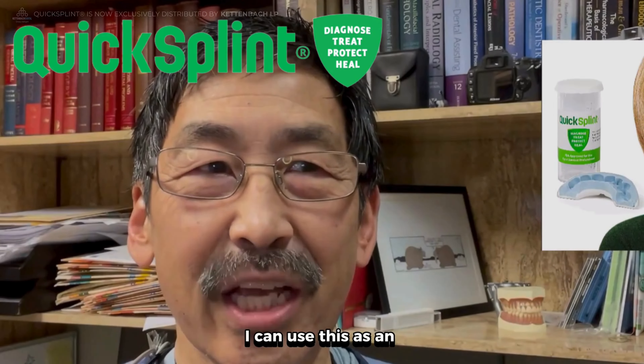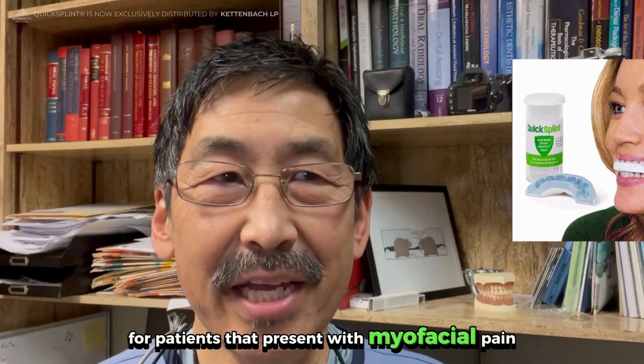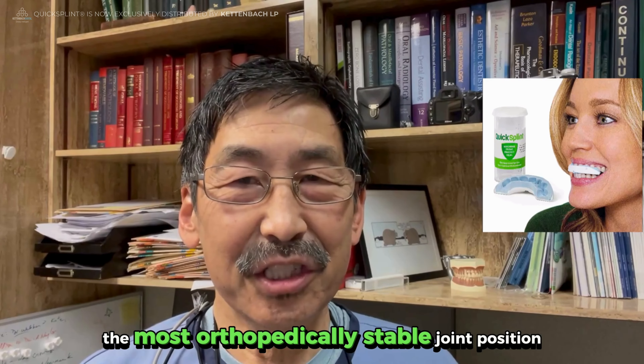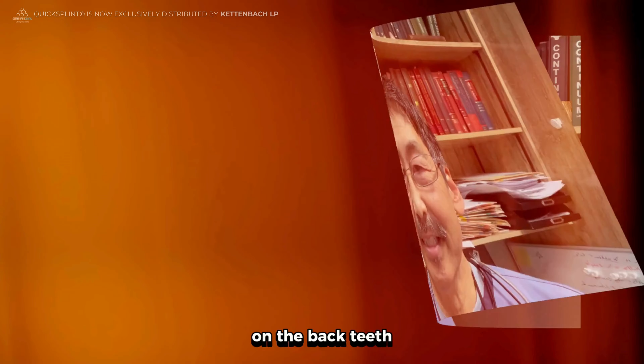The wonderful thing is I can use this as an immediate temporary splint for patients that present with myofascial pain, and as well as use it to help me determine and locate the most orthopedically stable joint position by removing all the posterior interferences on the back teeth.